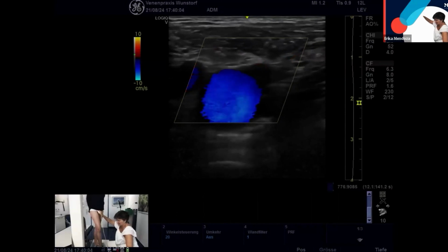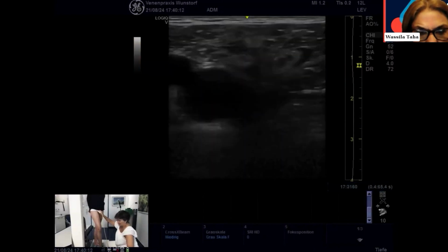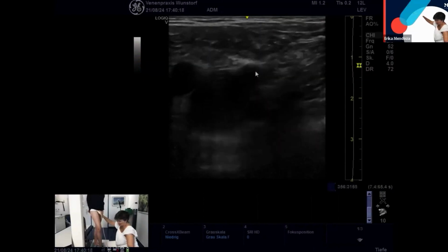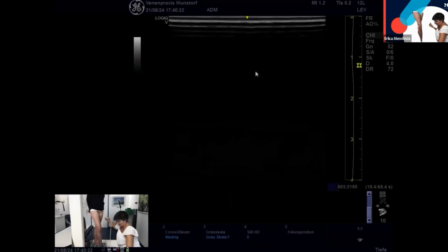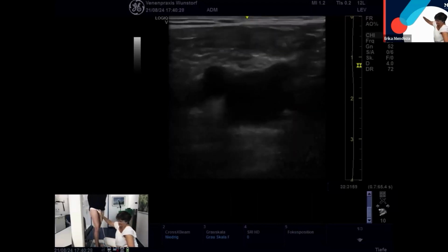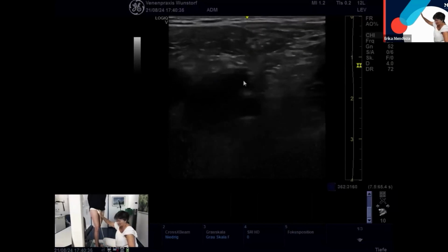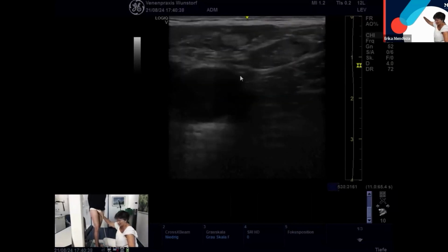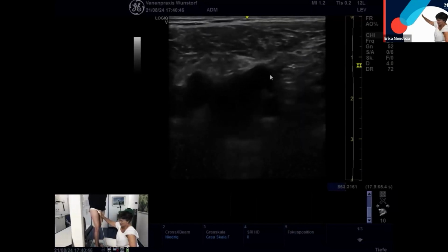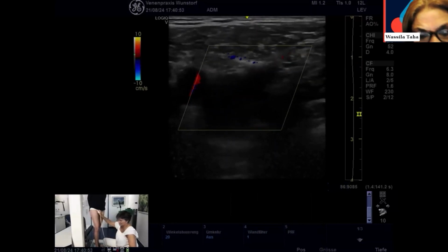There was a little tiny flow in the epigastric. The reflux, yes. From where does it come? From the epigastric, or from where? It was like here, but it's a healthy flow. The only problem is that there is no refluxing. Definitely, there are people with surgery. There is no saphenous vein here. She already had surgery, and there is no vein here. You have a little bit of a stump here, and there was a tiny reflux coming from the epigastric vein.